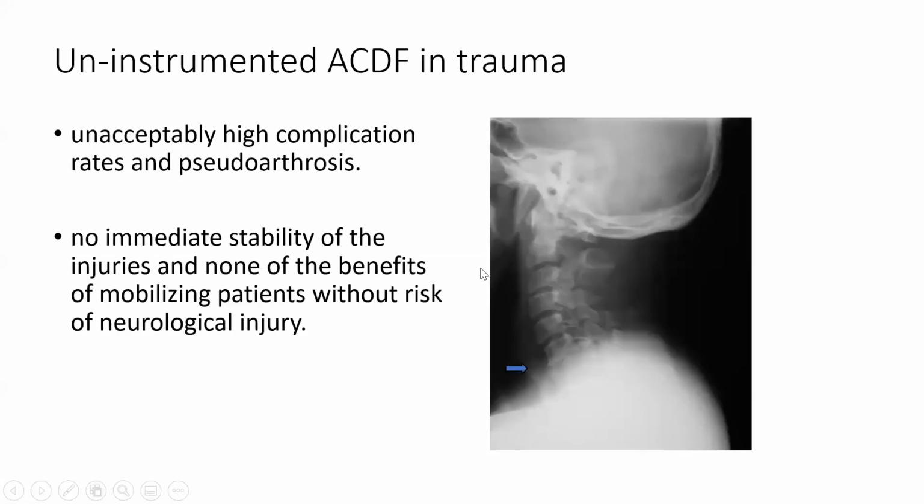So I'll just skip through this. So ACDF, so anterior cervical decompression fusion. Here's a patient with a dislocation, looks like unifacet. You need to instrument this, okay? Because this patient, even if you get it reduced, it's still got no bony healing potential. It's gone through the disc and it's gone through the facet joint, so there's nothing to heal on here. So there's a very high incidence of redislocation. So you want to instrument this.